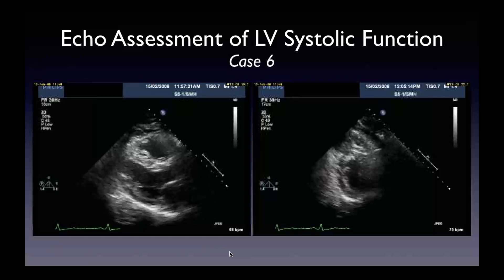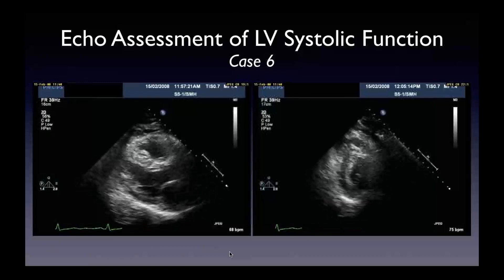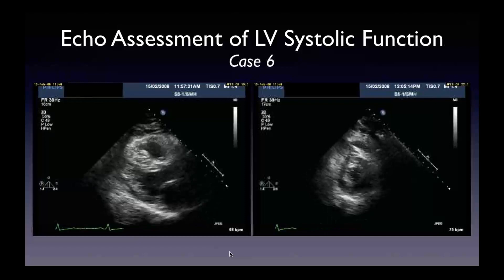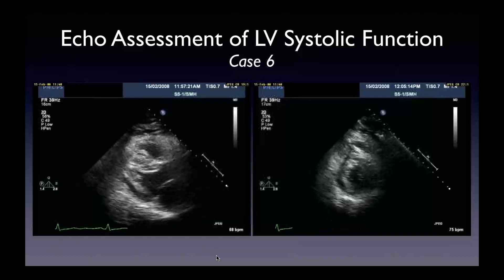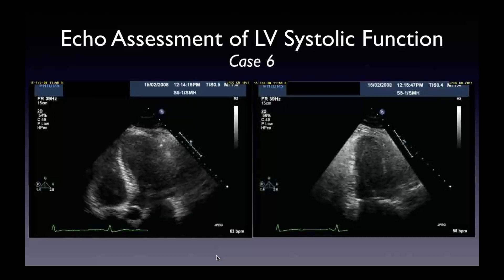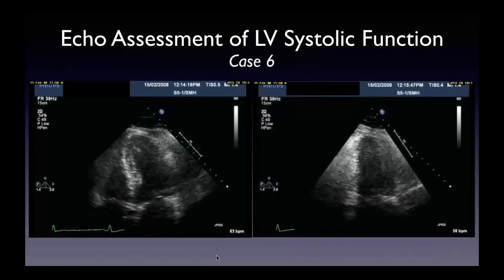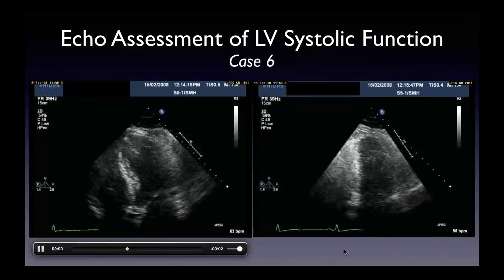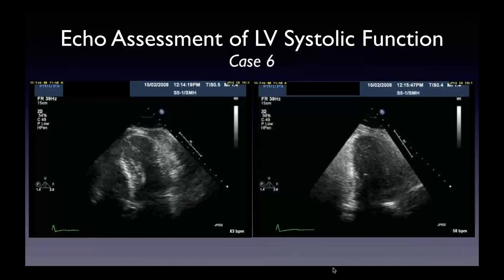A case illustrating the use of contrast for LV systolic function assessment: parasternal long axis and parasternal short axis show almost hyperdynamic systolic function with near cavity obliteration. From these views, the LV ejection fraction looks normal, probably above normal, maybe in the 65 to 70% range. But in the apical four and two-chamber views, there's a drop-off in quality of endocardial definition — the apex is not well seen, the lateral wall is not well seen, and none of the walls are really well seen.